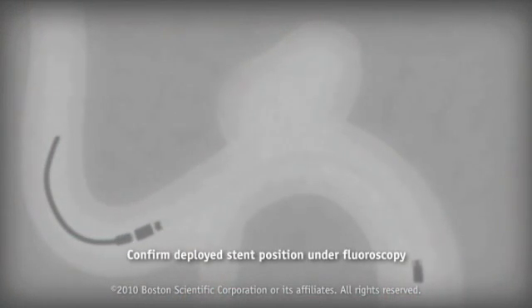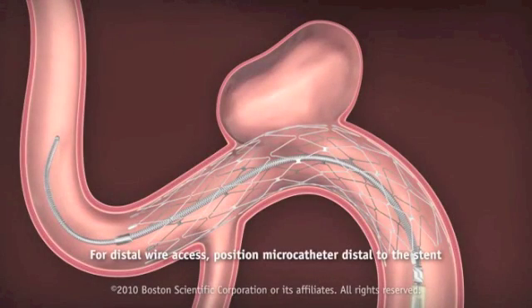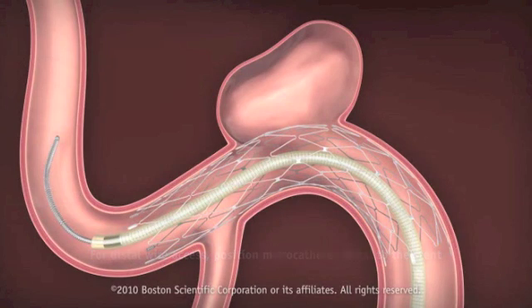The stent's distal and proximal markers will expand as they exit the microcatheter. Confirm deployed stent position under fluoroscopy. With the stent fully deployed for distal wire access, position the microcatheter distal to the stent. Once the microcatheter is in the desired position, remove the stent delivery wire.